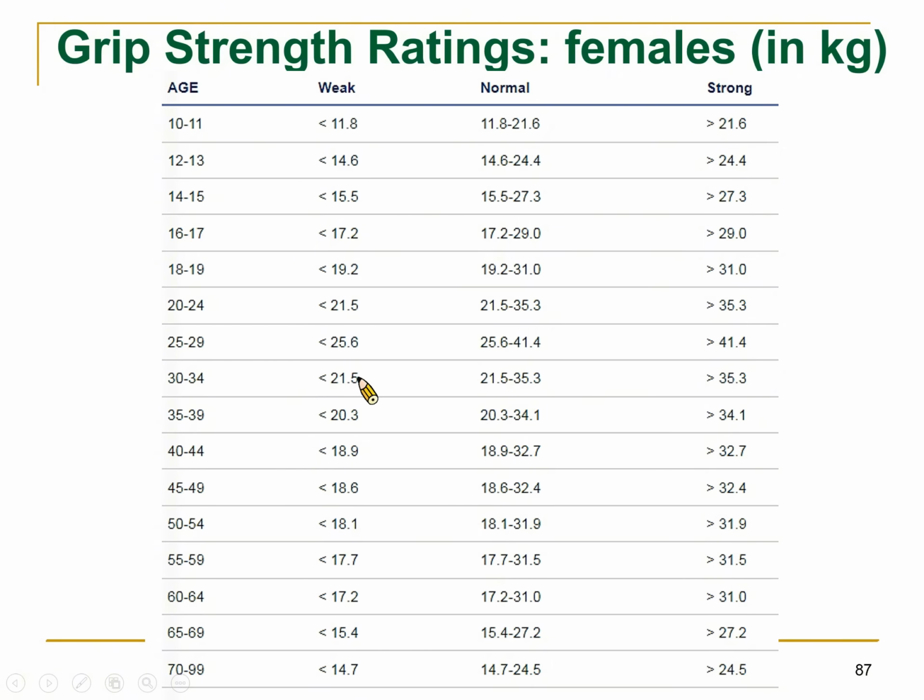We call that weak. OK, 大家可以自己圈一下，给自己一个 rating. So you can see from these two charts, you have a grasping function in the right side and the left side that is normal, or weak, or strong.